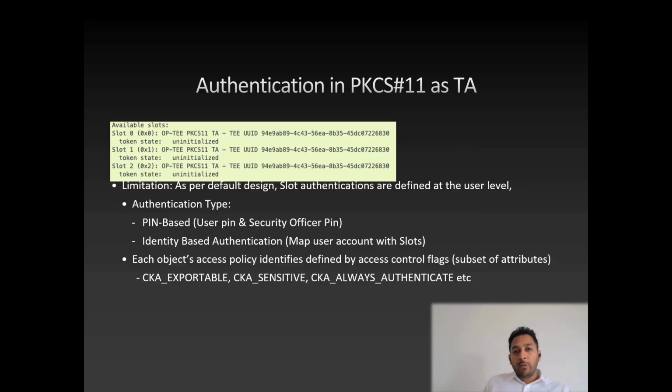Okay, authentication in PKCS11. This TA also has authentication because it needs to authenticate those calls, authenticate the application that's making the call to the TA. That way it needs to make sure it's the right caller.